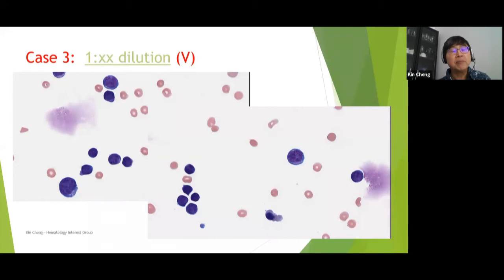Lots of mononuclear cells. Some of them look very abnormal, like blastish looking. For those of you who have dealt with pediatric samples, newborn or young folks, the slides for young kids are very difficult.